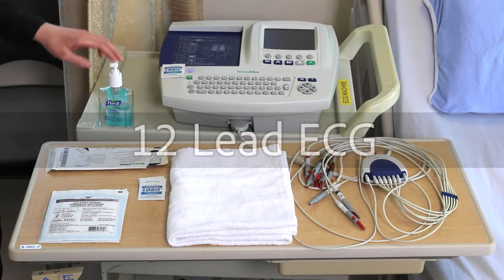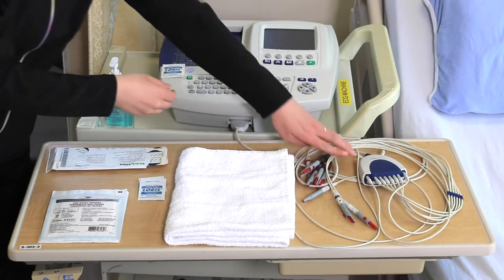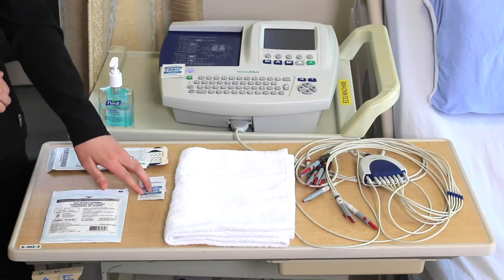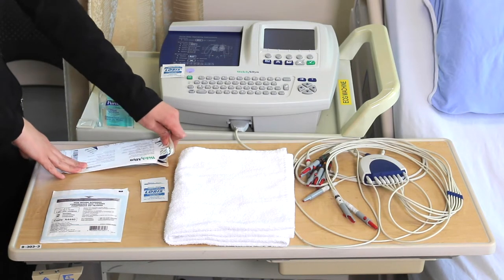For a 12-lead ECG, you will need hand sanitizer, an ECG machine, leads with the cables attached, electrodes, gauze, skin prep if required, and a towel to maintain privacy. With your electrodes, ensure that you have 10 per sheet.